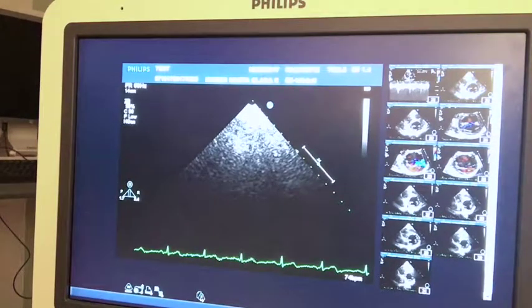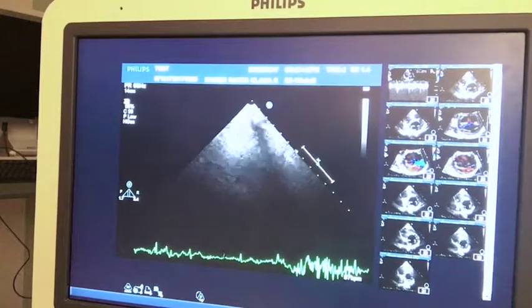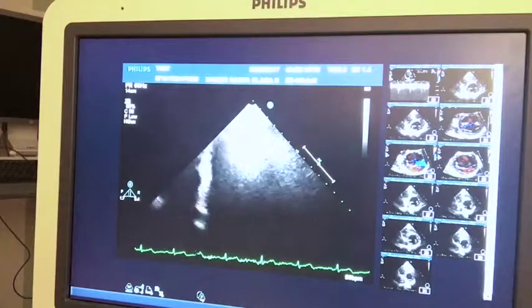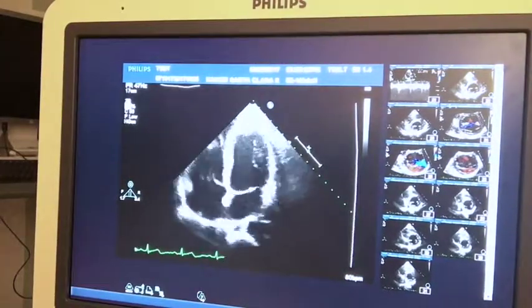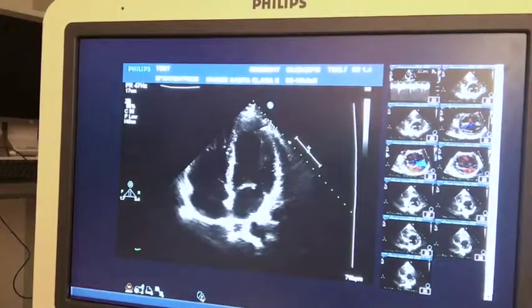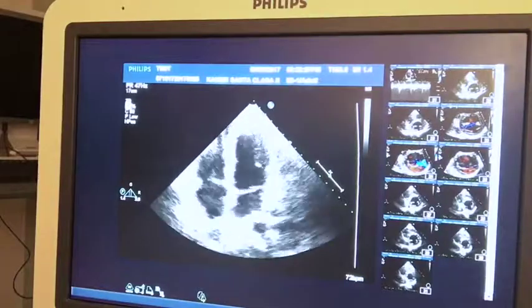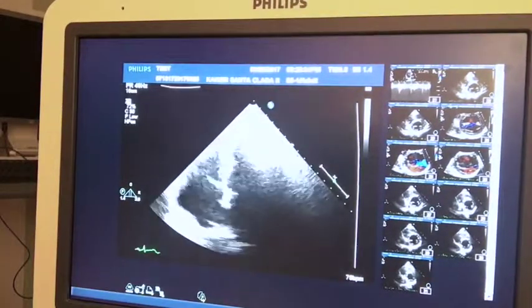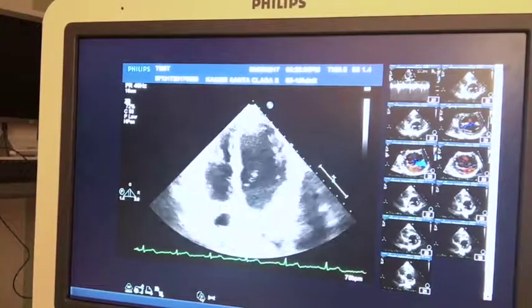And then now I'm going to shift and reposition the patient to make it a little bit easier to see. And I'm going to go down to the apical views and find a window. So this is a reasonable window. You can see pretty clearly. I'm going to re-evaluate and set up all of my focus, set up my view to maximize scale, all of these things.